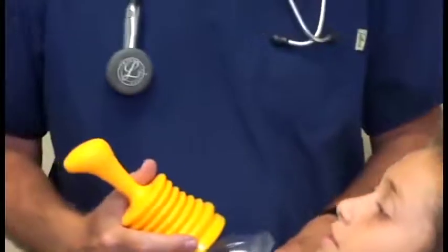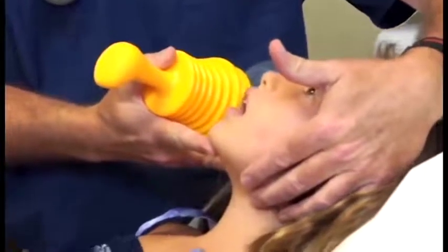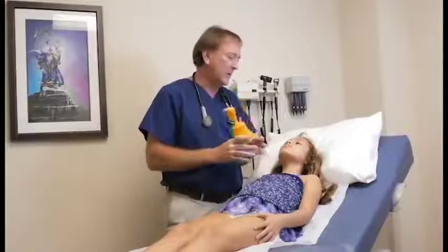So you've identified a person as having trouble getting air into their lungs — you don't have much time. The device is like a standard ambu bag face mask found in all ambulances and ERs. It's sealable and fits almost any size.